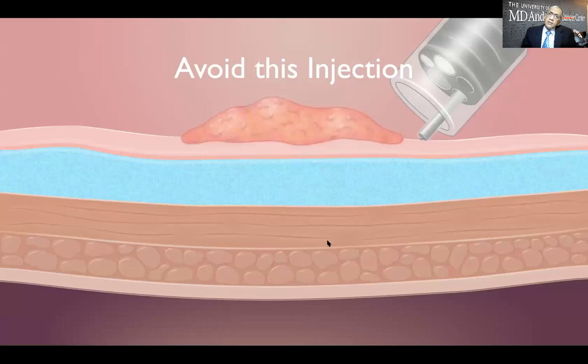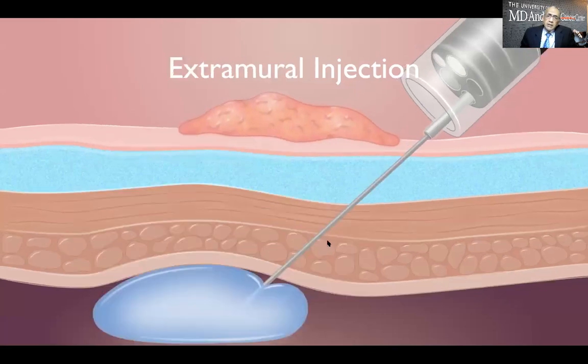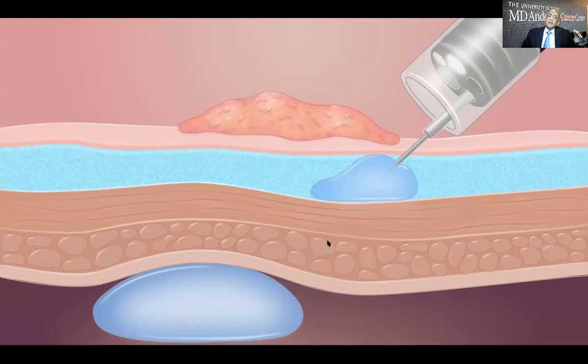There are a few things that I want to share with you up front that you should avoid. You should not bring your catheter out and ask your assistant to plunge the needle and inject. In that case, what happens is the needle has gone through and through that thin 3 millimeter cecum that has been distended, has become much thinner, and you deposited all the fluid outside. If that happens, you gently pull the needle back and then inject to find the submucosal plane. So something to keep in mind.